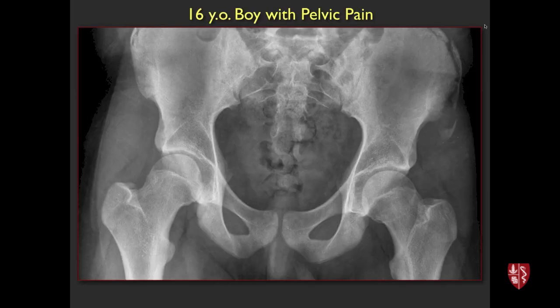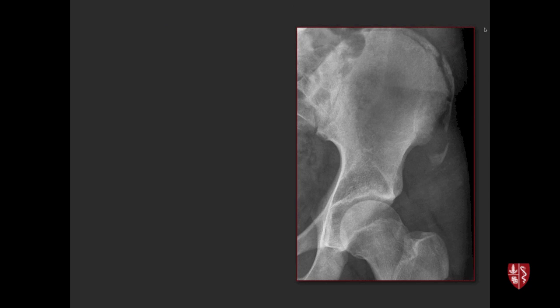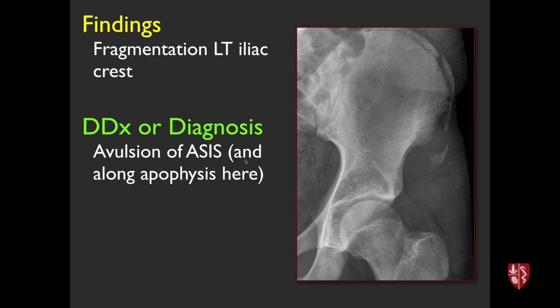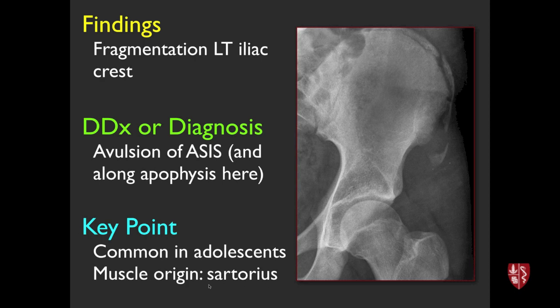Let's dig into the real cases. Here's the first case — the iconic image. What we're seeing is fragmentation along the iliac crest in a skeletally immature patient, with part of it avulsed off. This is avulsion of the anterior superior iliac spine with avulsion of a little bit of his apophysis. Key point: fairly common in adolescence, and the muscle origin there is the sartorius.